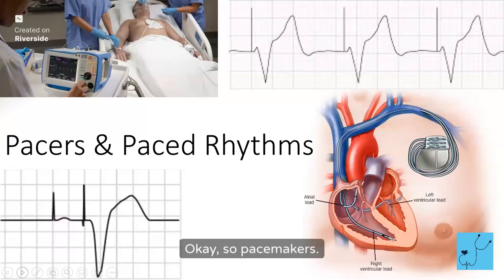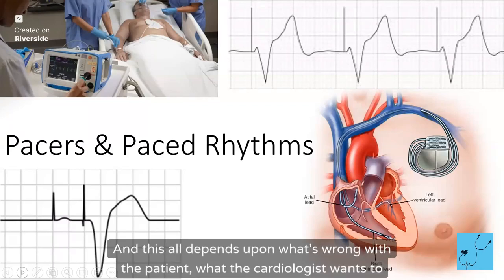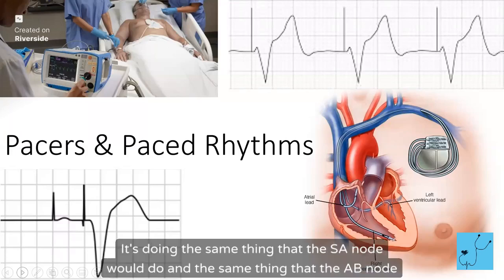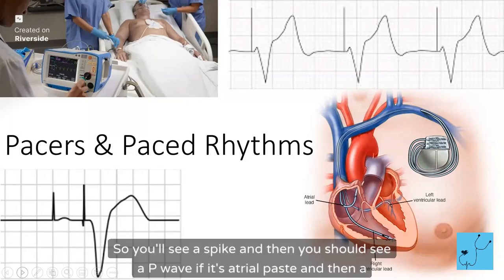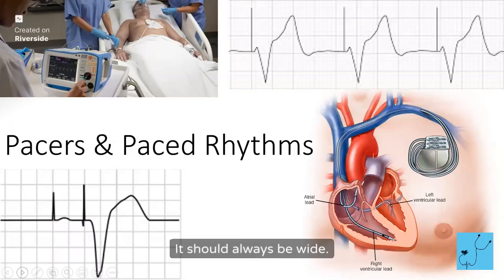Okay, so pacemakers. We can put a wire in the atria and a wire in the ventricle. This all depends upon what's wrong with the patient, what the cardiologist wants to do. For our purposes, it's doing the same thing that the SA node would do and the same thing that the AV node would do. Every time you get a spike, the pacemaker has sent an electrical shock. So you'll see a spike, and then you should see a P wave if it's atrial paced, and then a spike and a wide ventricular beat because it's coming from the ventricle. So it's always going to be wide.